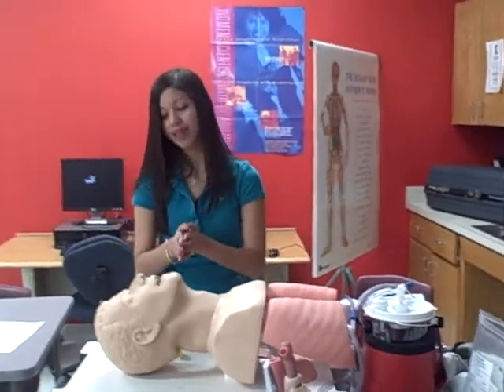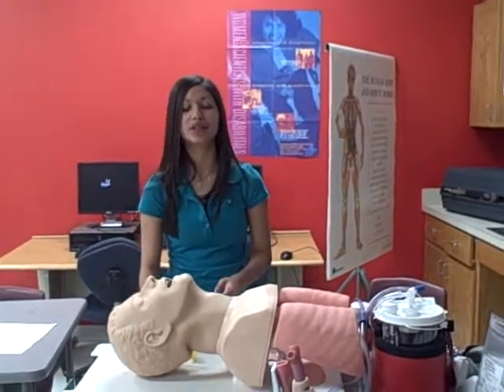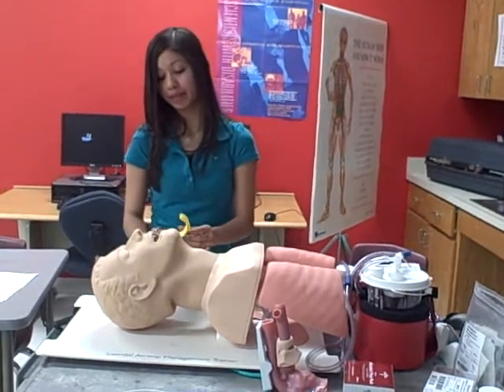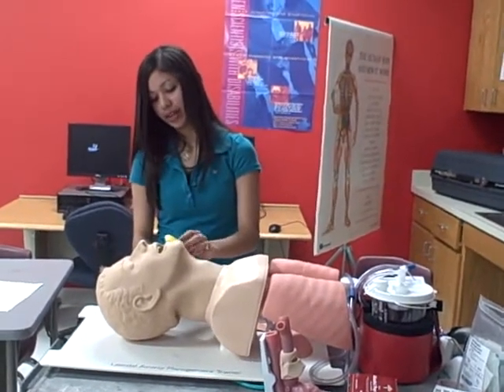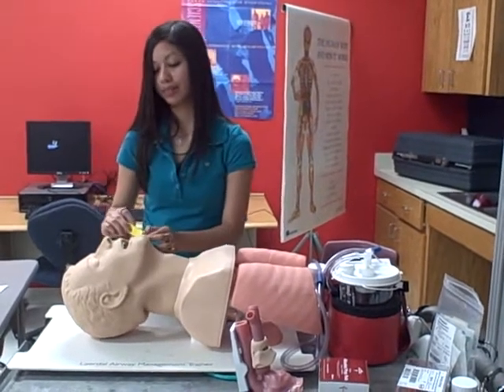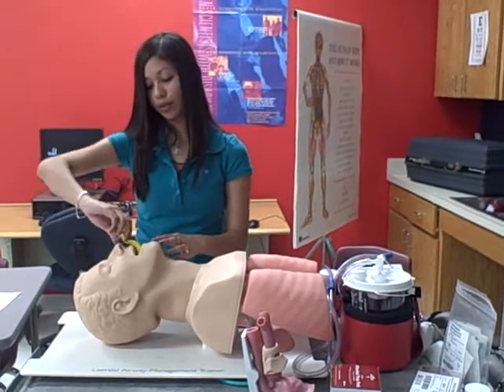BSI for my buddy and I. I'm going to start by doing a head-tilt chin-lift and I'm going to insert an OPA. I'm going to measure it from the tip of the ear to the tip of the mouth. And if it fits, I'm going to insert it backwards and when I hit the soft palate I'm going to rotate it.